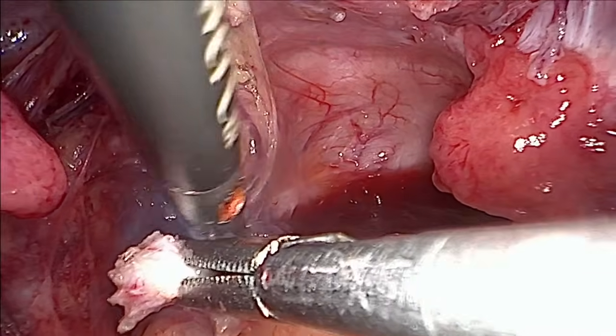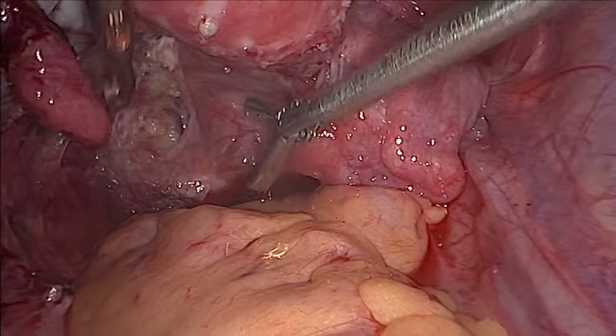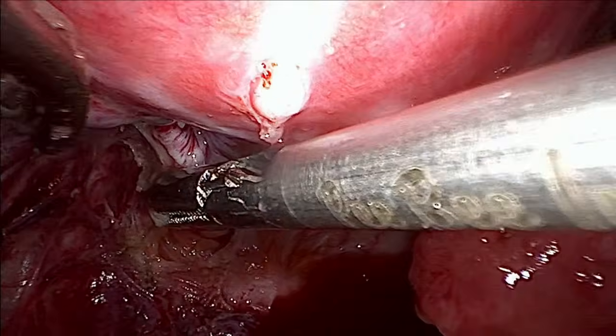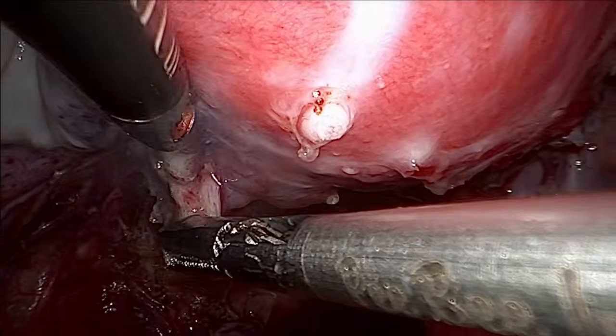This was the left uterosacral nodule which was already diagnosed. This is the uterosacral part of it. This is the uterus part of it.